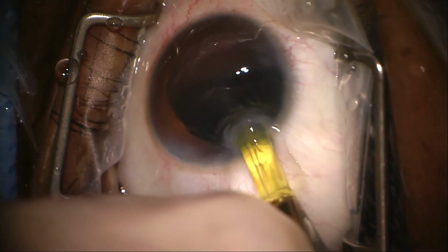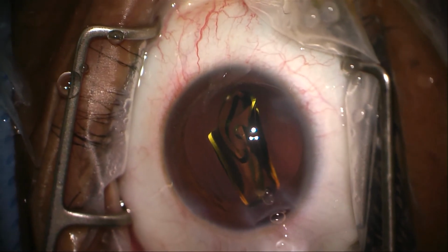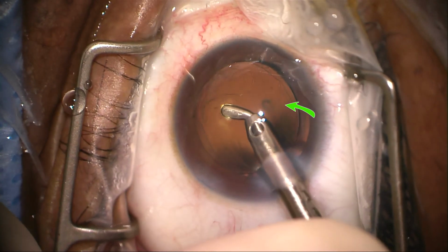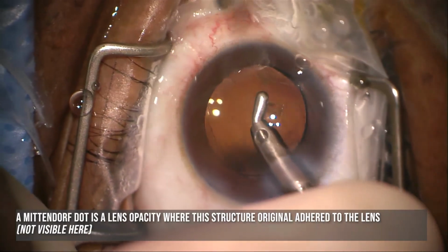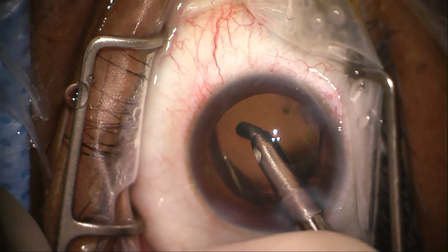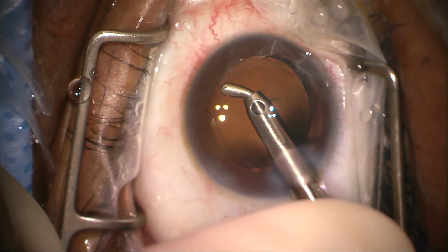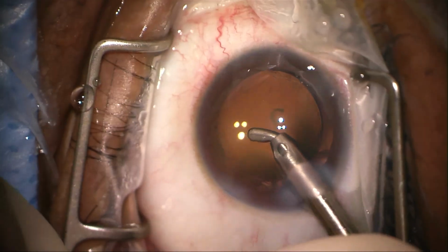Anyway, that's that. We'll slip the lens in, and then there's one sort of bonus feature that turned out to be pretty cool with this case. If you look behind the lens, you'll see this snake-looking thing that is just sort of dancing around and is almost attached to the lens. That's just a piece of the persistent hyaloid artery. And I don't think I've ever seen it sort of dance around almost like an octopus or a squid or something, but you can see that little shadow dancing behind it, which is kind of fascinating.